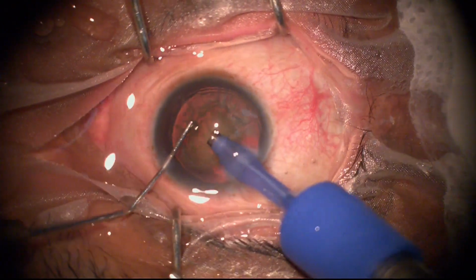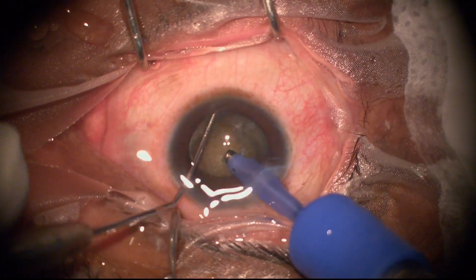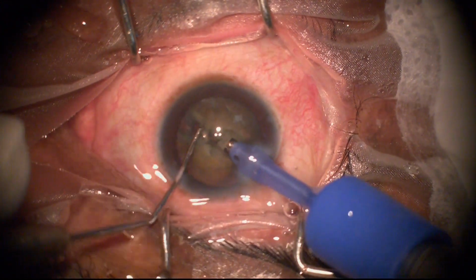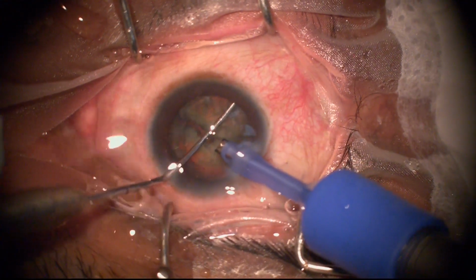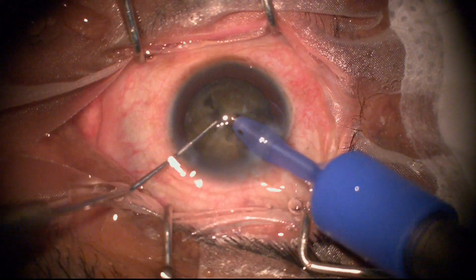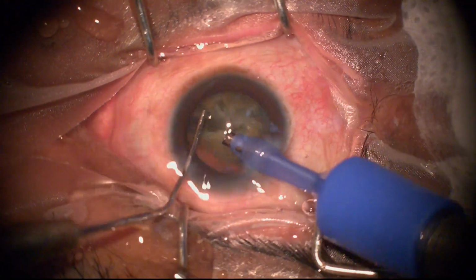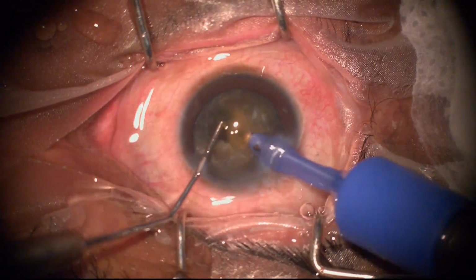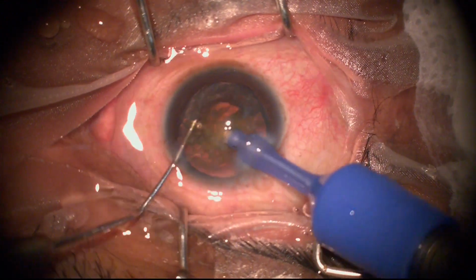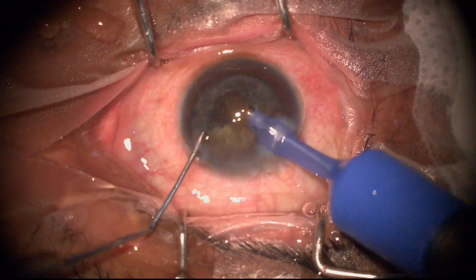and you will wear glasses. So with the glasses, each eye will receive only one image. So the TV is projecting both the images, but each of your eyes views only one image. So you get that stereopsis on the monitor. And because that image is captured in 4K and that monitor is large enough, people say that it gives you a very good view. And then you operate by looking at the screen.